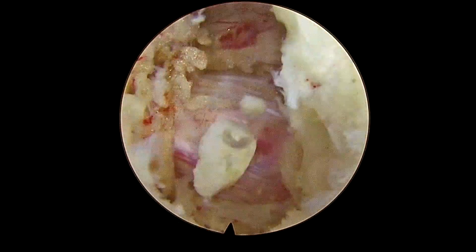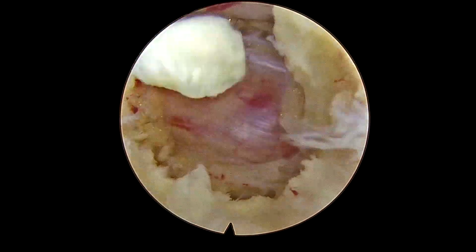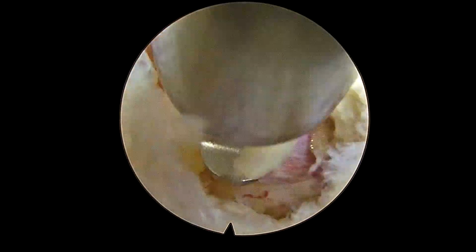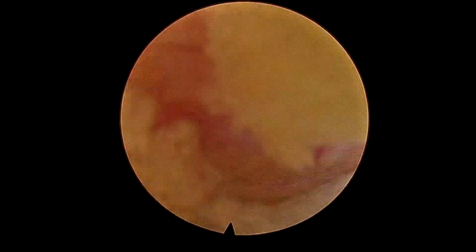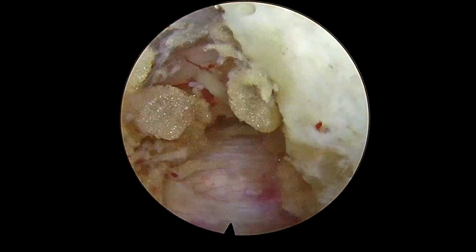So here I am removing ligamentum flavum in the lateral recess and some part of the medial border of the superior articular process here. The purpose here is to create enough space laterally so that I can retract the nerve root medially with the help of the working sleeve. So this was a contained disc.